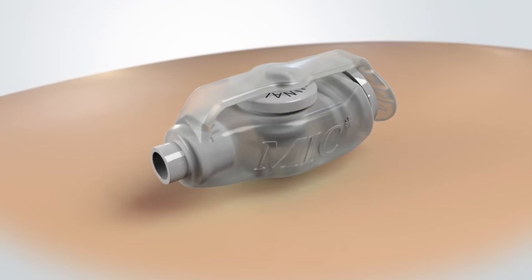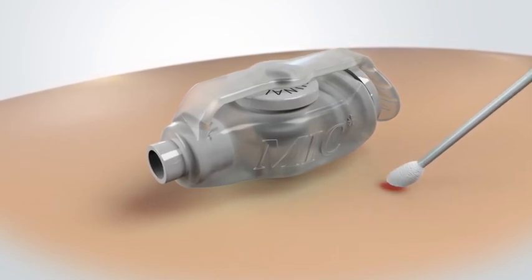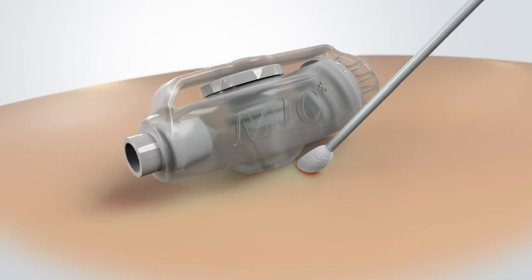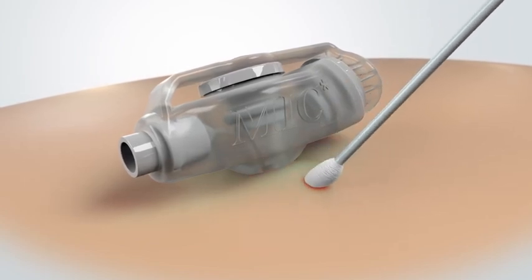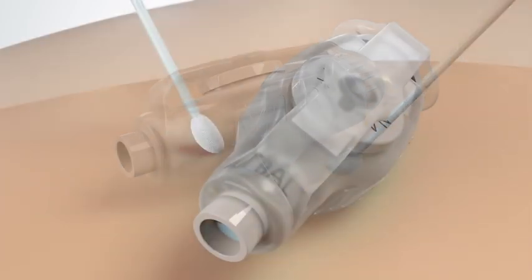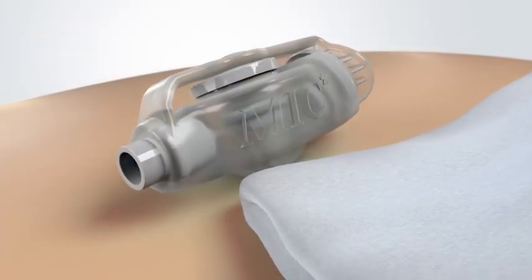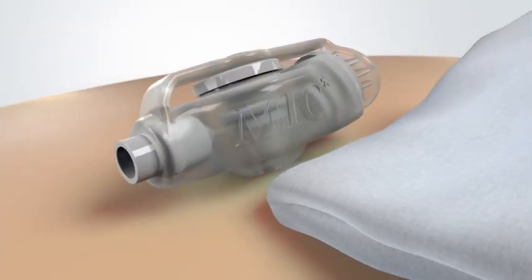Use a cotton-tipped applicator to clean the skin around the stoma site with mild soap and warm water. Start next to the tube using circular movements. Continue cleaning, working outward from the tube. Clean and gently dry the whole area thoroughly.